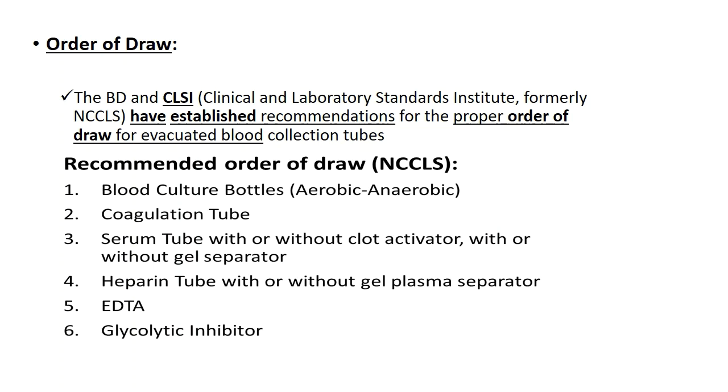As per the Clinical and Laboratory Standards Institute, formerly NCCLS, there are established recommendations. First is blood culture, because after decontaminating the site of puncture with alcohol, that is the most sterile site, and you should collect the blood culture in the most sterile fashion. Then immediately coagulation. Why not others first? Because otherwise the blood flow gets slow and the PT may falsely get elevated. So second is coagulation.